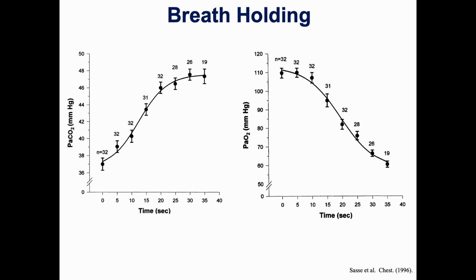Breath hold is very attractive. It is inexpensive and it's easy to implement. It requires patient cooperation, which for the most part isn't an issue.